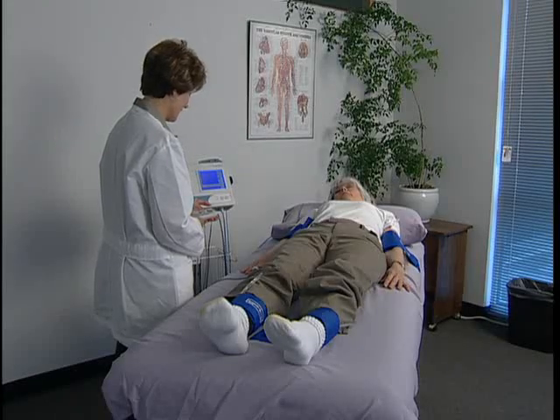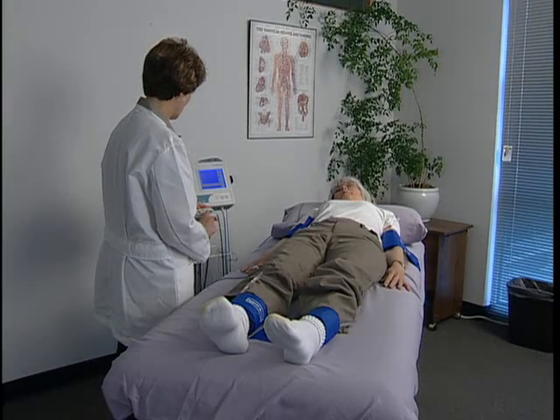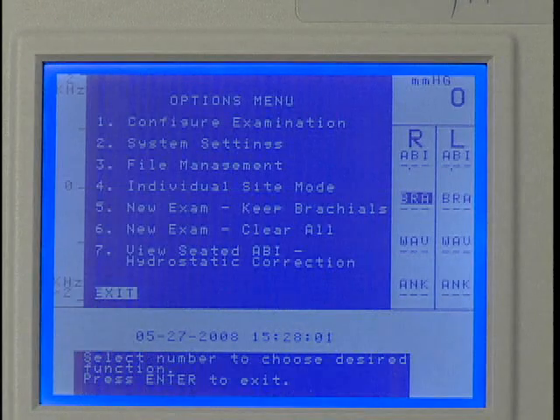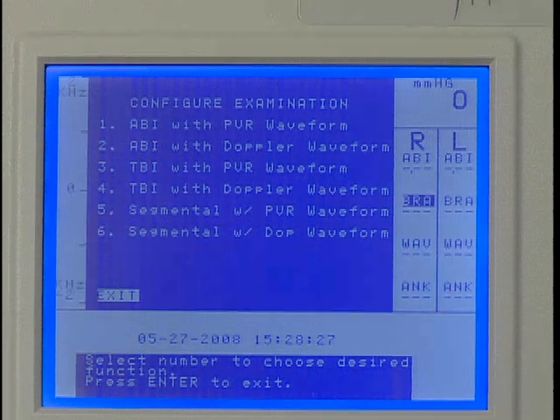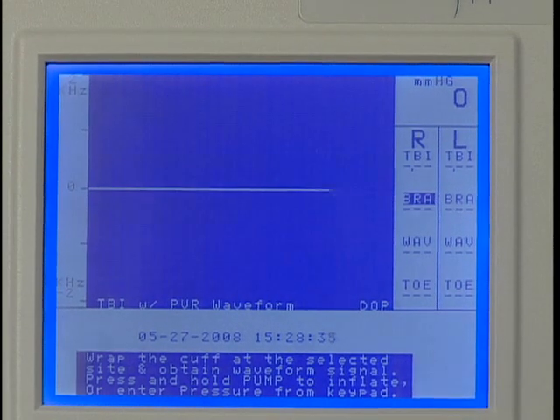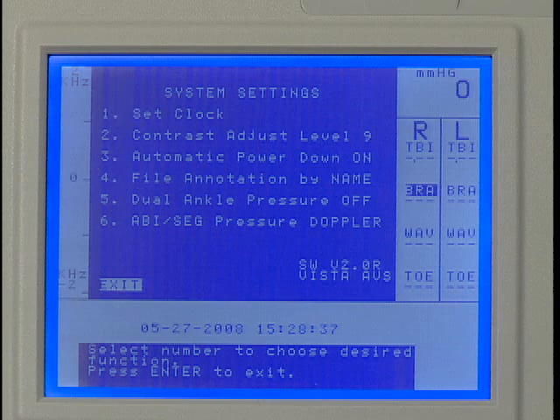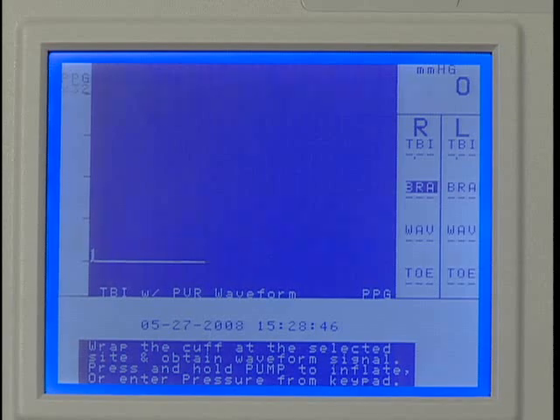To perform a TBI using a PPG probe for pressures and PVR for waveforms, press Enter Menu to open the Options menu and press 1. Press 3 to select TBI with PVR waveform. Press Enter Menu to open the Options menu again. Press 2 for the system settings. Press 6 to select PPG to obtain pressures, then press Enter Menu to exit.